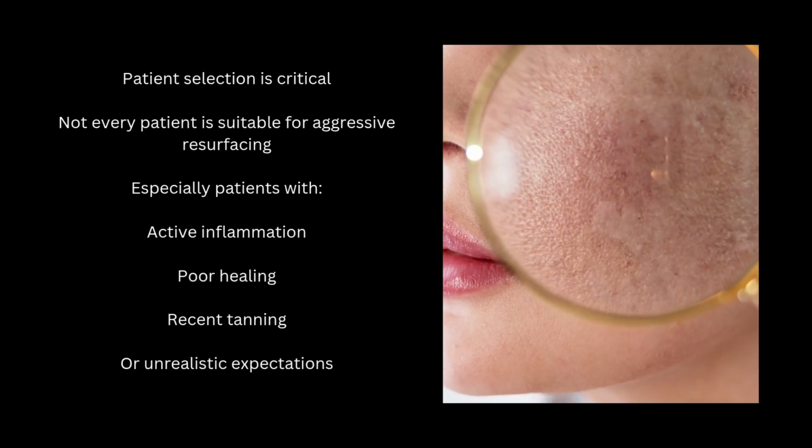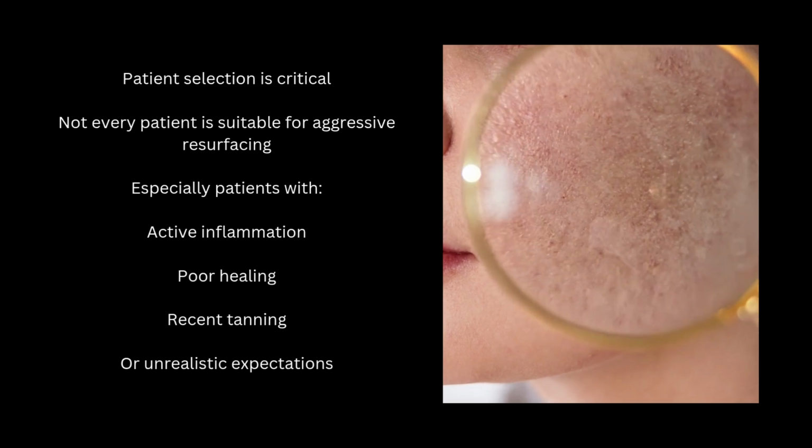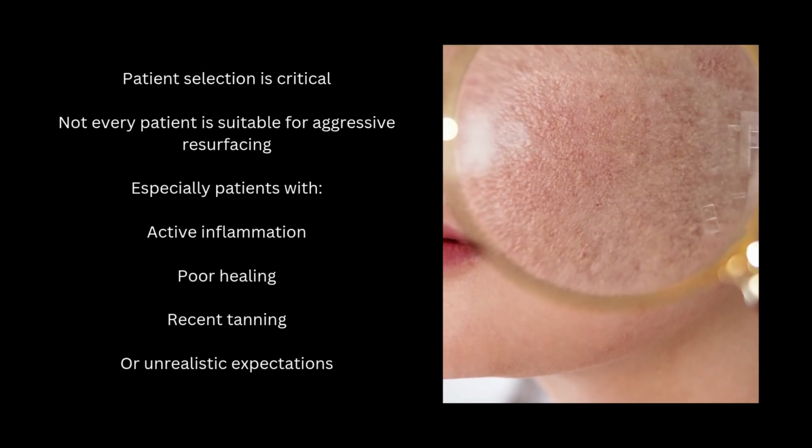Patient selection is critical. Not every patient is suitable for aggressive resurfacing, especially patients with active inflammation, poor healing, recent tanning, or unrealistic expectations.